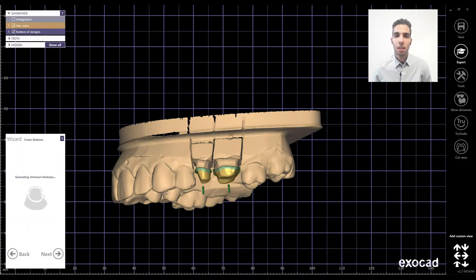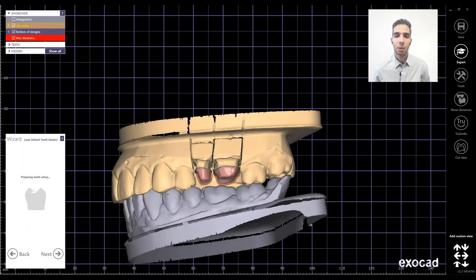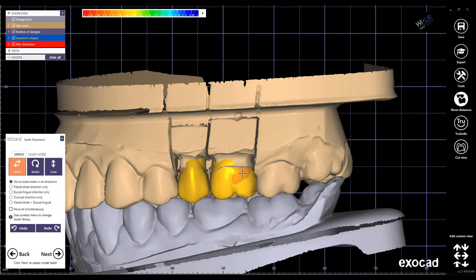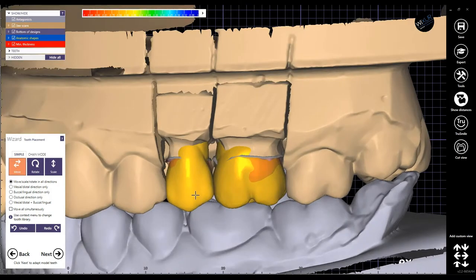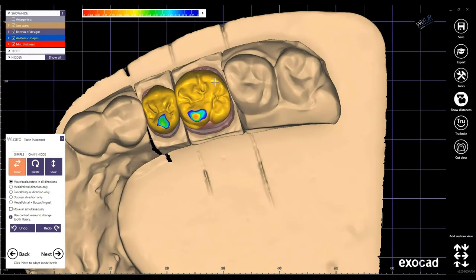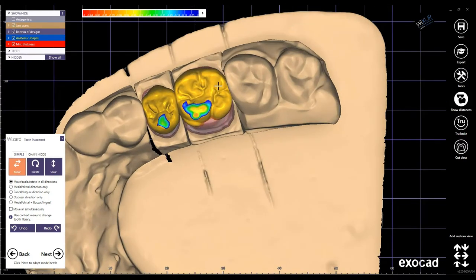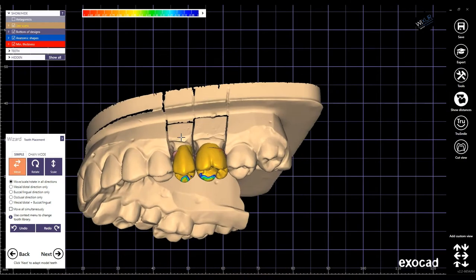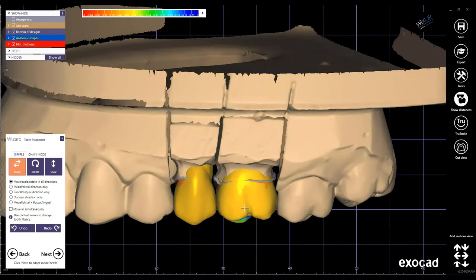We can now start with the design in this case — let me know your opinions in the comments. After defining the margin line and also the cement gap, I continue with the tooth placement. You can use also the hotkeys, as I always use, for faster and easier design. I also made previously other videos to describe completely how you can use the hotkeys in this step of tooth placement.